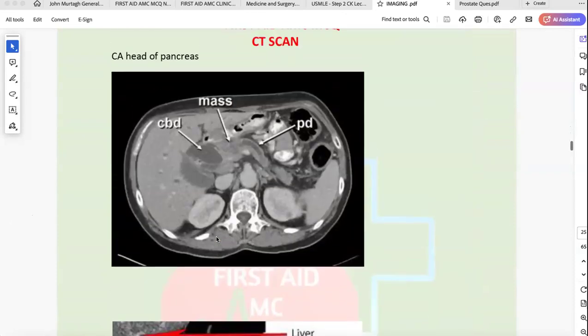So that's mainly large and small bowel obstruction. In our class, we discussed how to differentiate sigmoid volvulus and cecal volvulus. We discussed the treatment of it in GIT, so we would not go through that again. And we also discussed small and large bowel obstruction X-ray, okay?